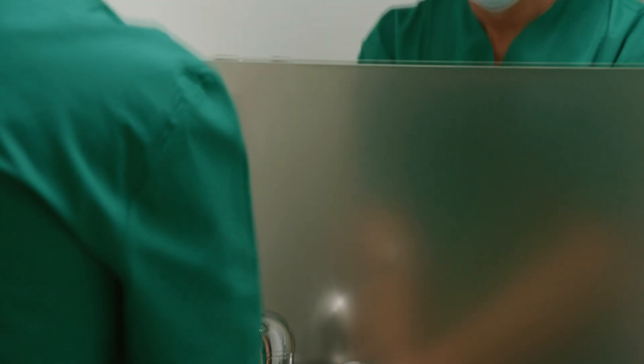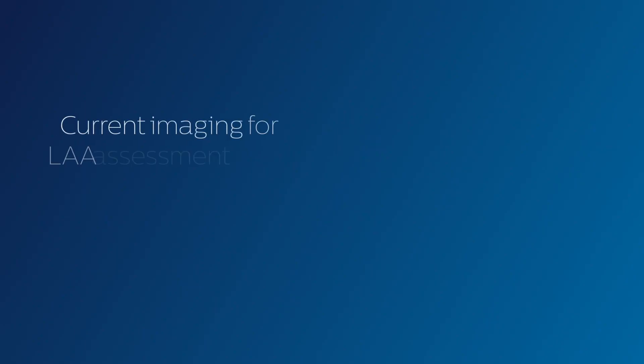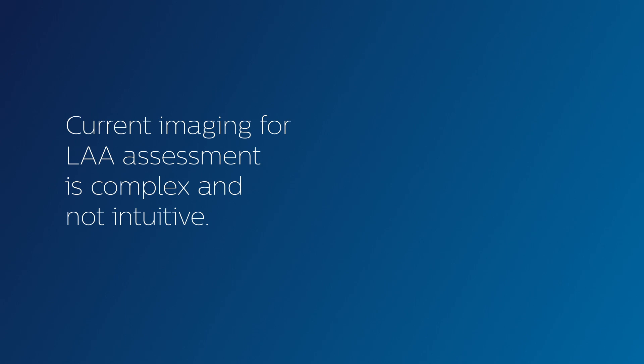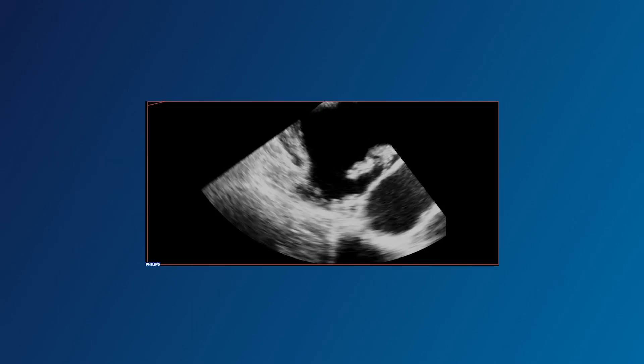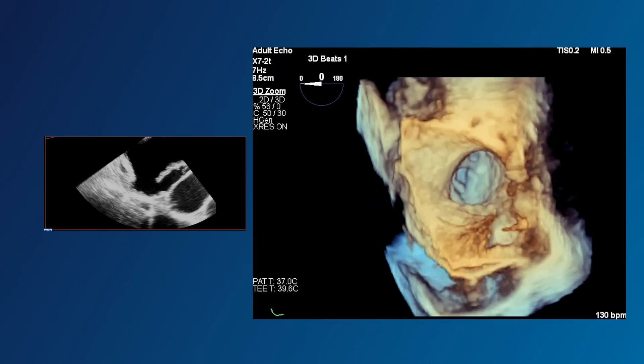When you're looking for answers, you want a realistic reflection on time. Currently, to assess the left atrial appendage for a procedure, you work with 2D and 3D imaging that's complex and not intuitive. You need specific skills and experience.